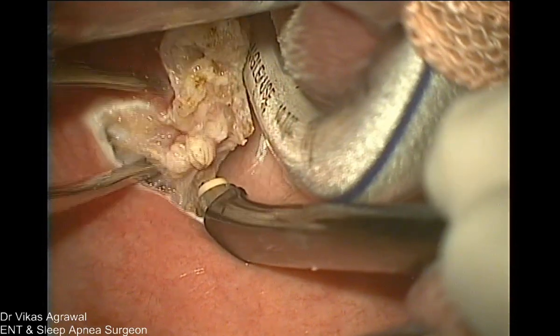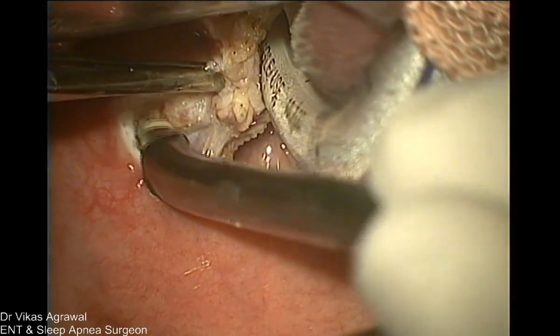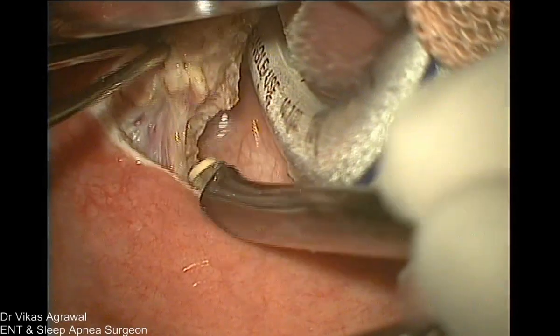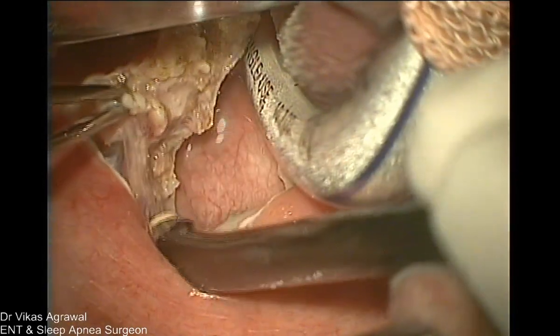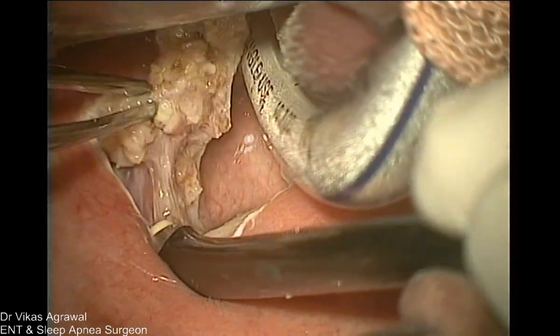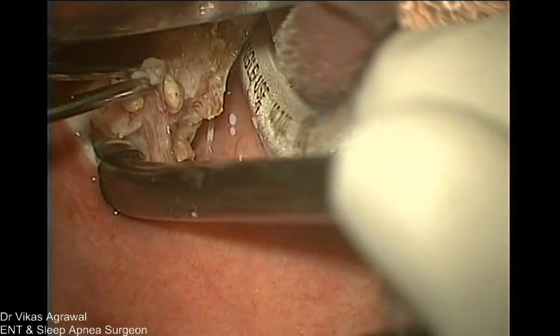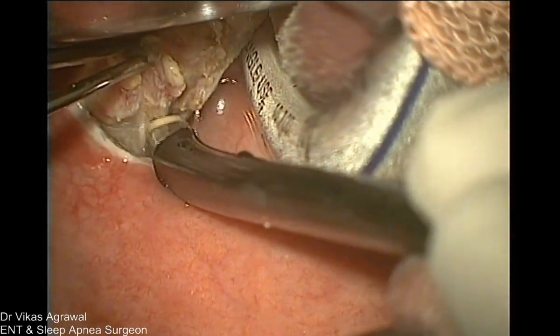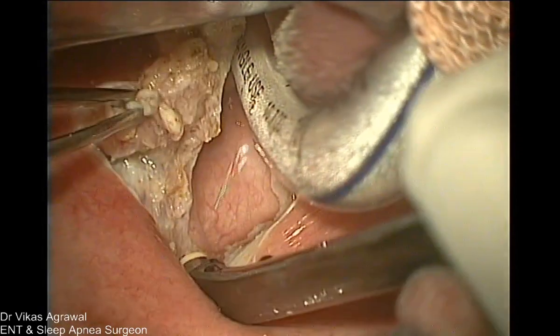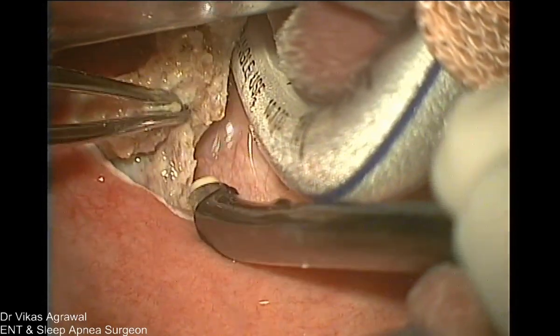And I'll get into the tonsil from here. Can you see the superior pole of the tonsil coming in here? Yeah, seen very well. So that's the superior pole of the tonsil. Now, here these are the vertical fibers of palatopharyngeus, which I need not actually cut because they are going vertically down, right? So they are part of the lateral pharyngeal wall. So I have cut the oblique fibers here. Can you see this? Yeah.